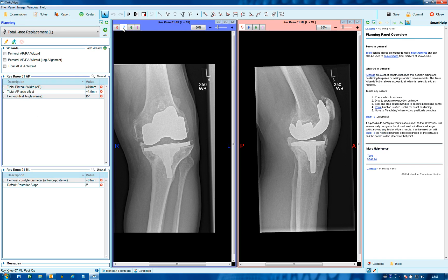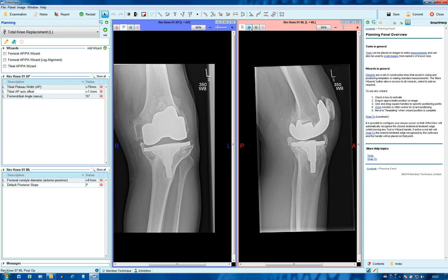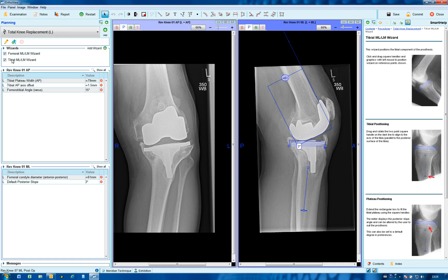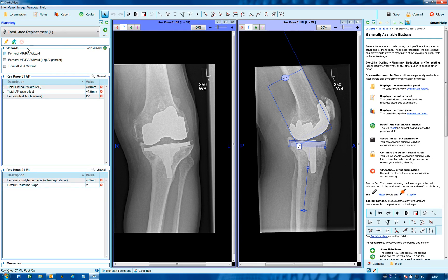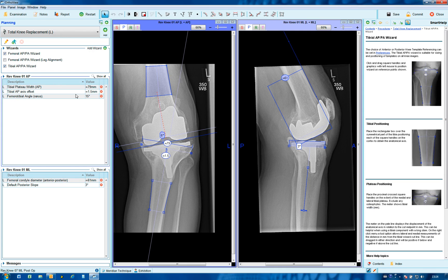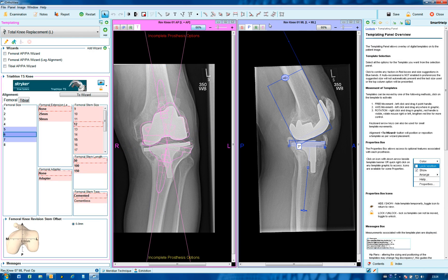The images have been taken to planning where femoral and tibial wizards have been placed in both views for sizing and positioning of the templates, and then taken to the templating screen.